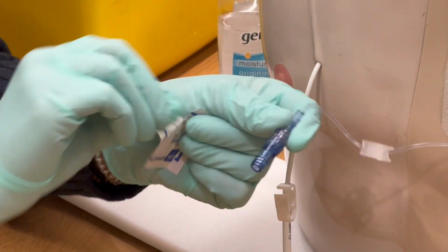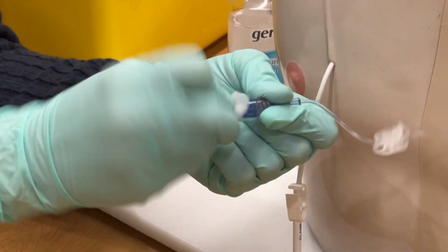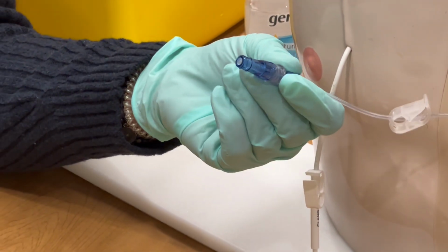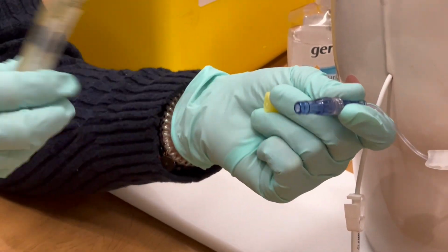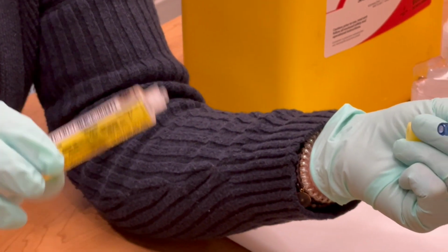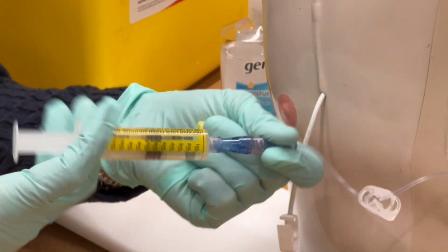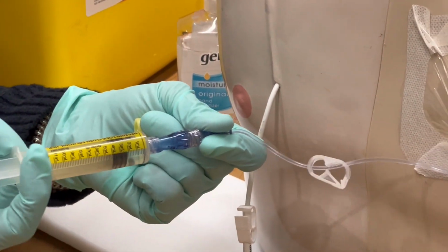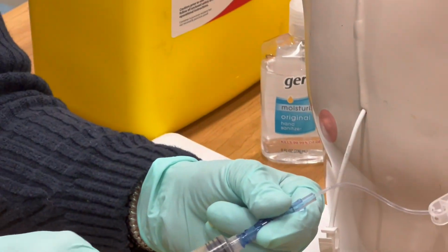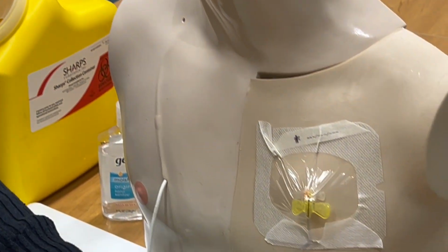Lastly, we're going to do the heparin after we clean. The heparin always goes in last. And it works the same way as the saline. We're going to pull down, break the seal, slowly push the air out, push and twist the syringe on, open up our clamp, and flush with a push-pause technique. And then we're going to close our clamp, take off the syringe, put it in the bucket. So now the port is flushed.